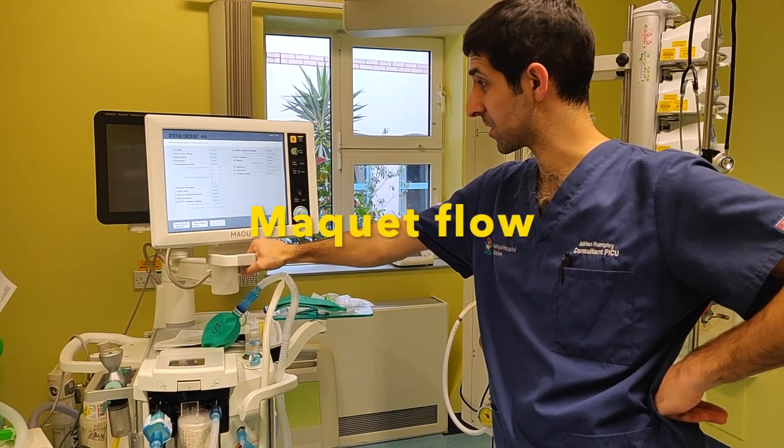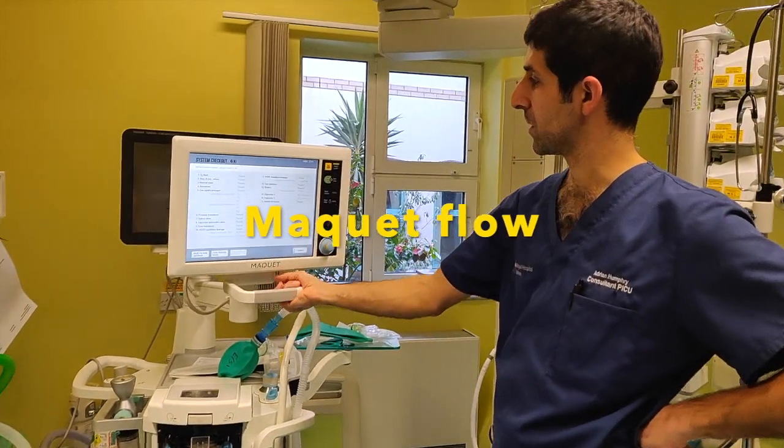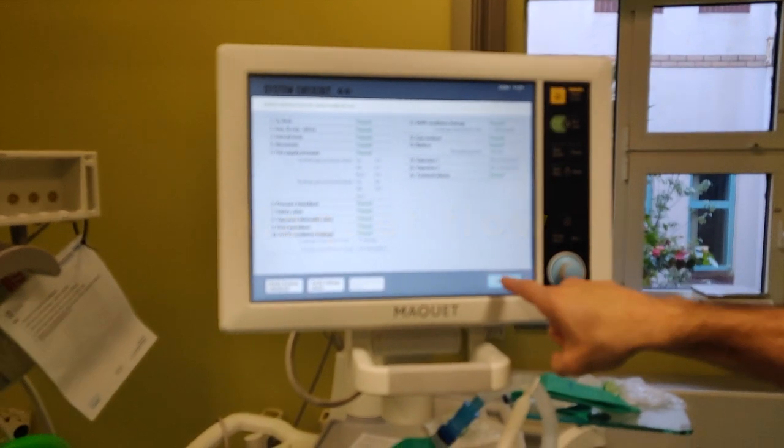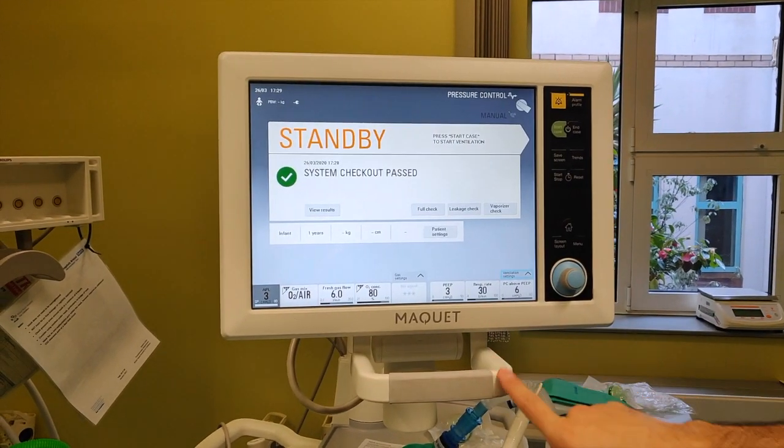Half an hour later, the check's finished, and it leaves you with this screen saying things are passed and not connected, which is fine. Just press standby and that will take you back to the original screen.